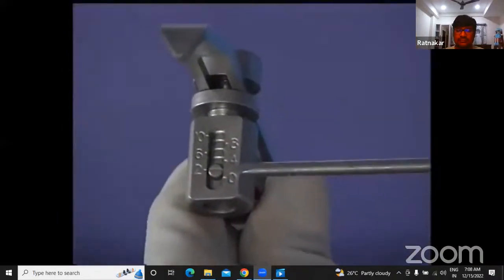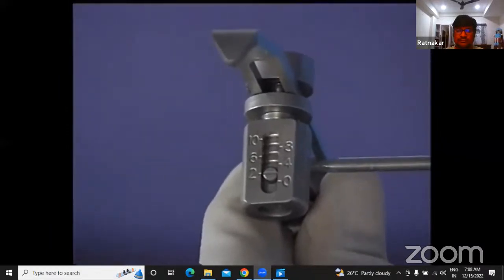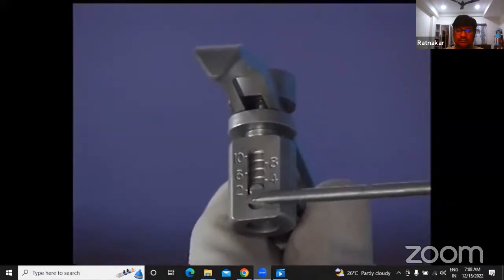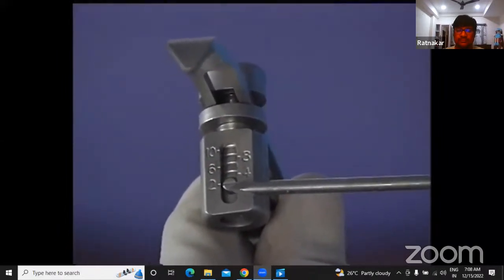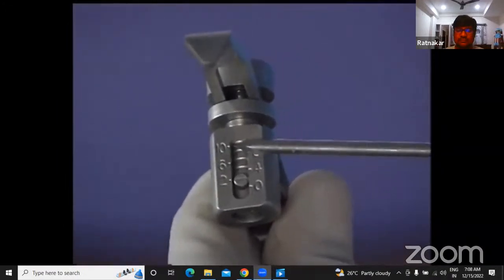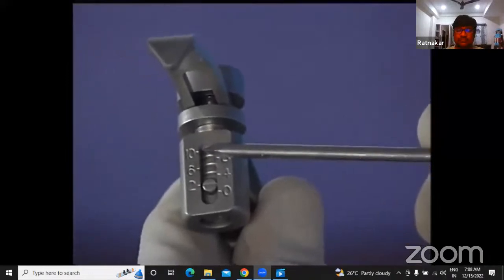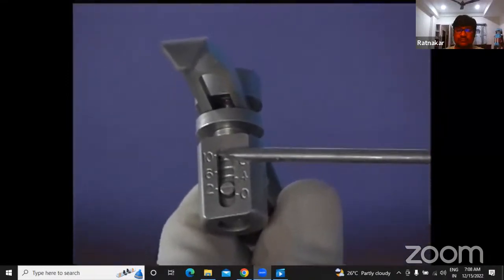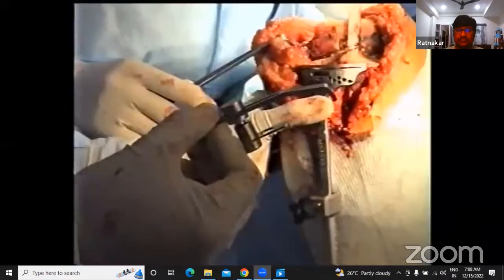That is the stylus. There are marks here from 0 to 10. If you are taking the medial tibial corner as a reference, always put this mark on 2. That means you are cutting 2 millimeters more than the worn out surface. If you are taking the lateral tibial condyle as the reference point, you put it as 10. That means you are cutting 10 millimeters out of the tibia, irrespective of this worn out medial tibial condyle.